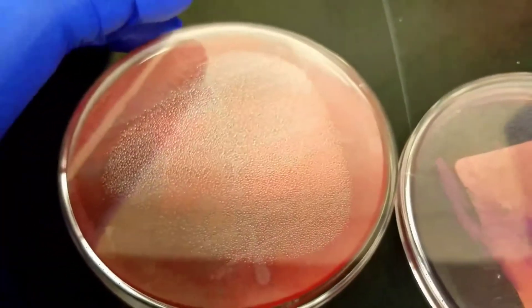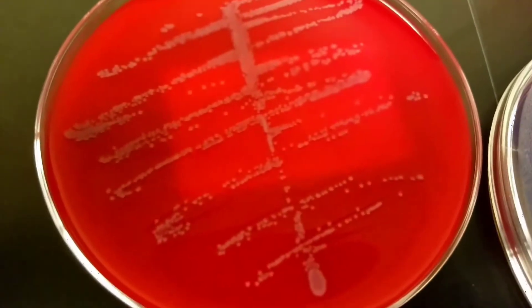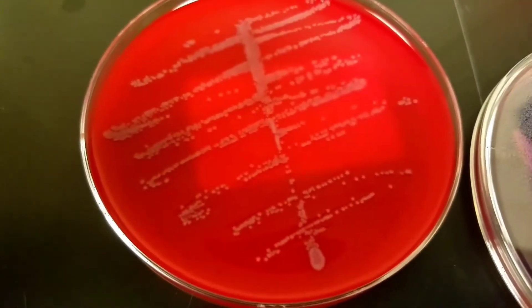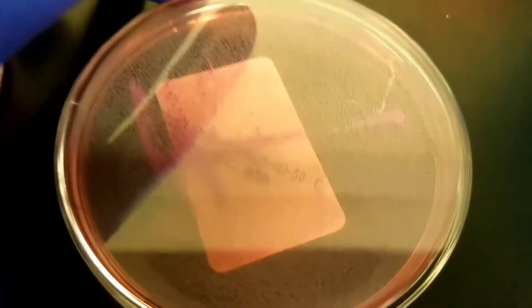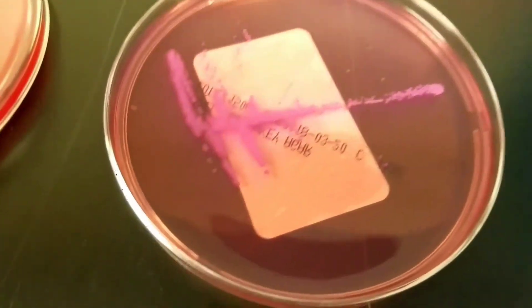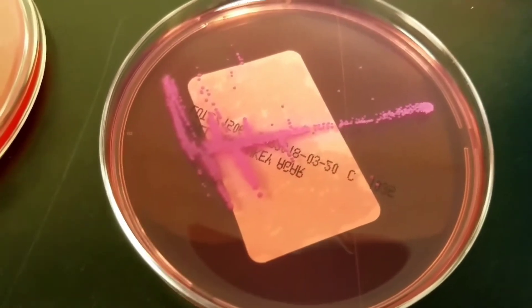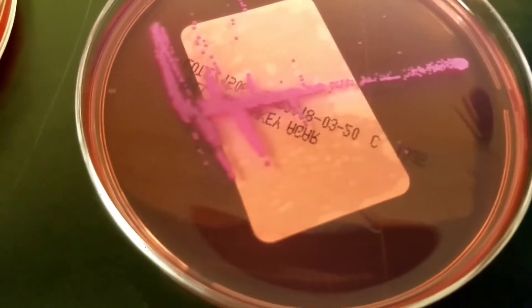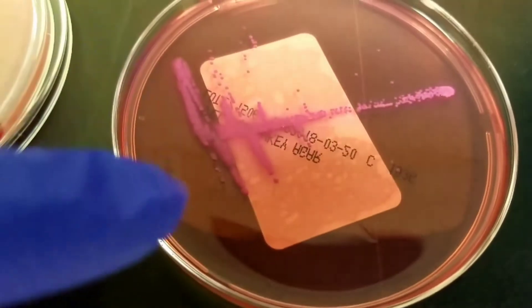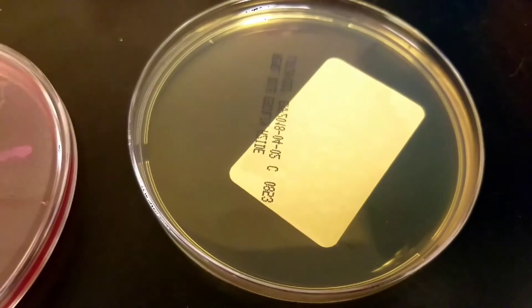On this next culture we have what looks like about one colony type. On the MacConkey we do have some growth — looks like the same type of colony, really kind of small with some haloing effect right around the outside. But there's no growth on the BEA.